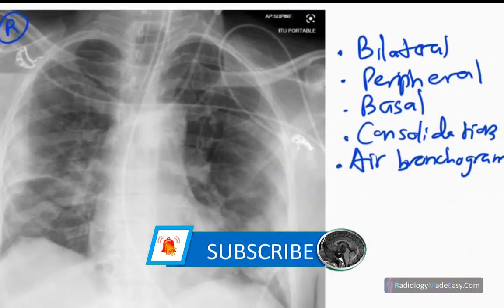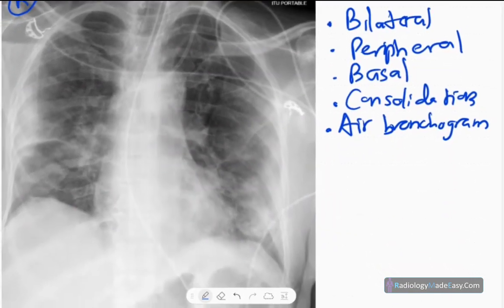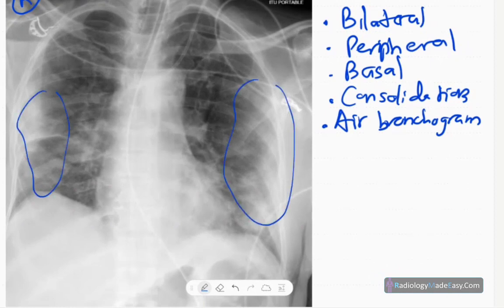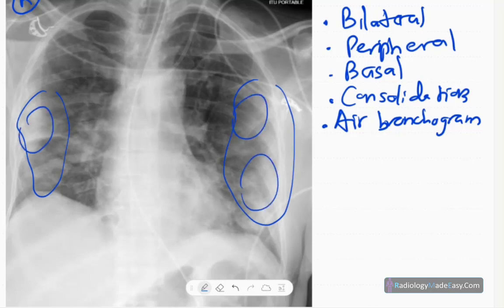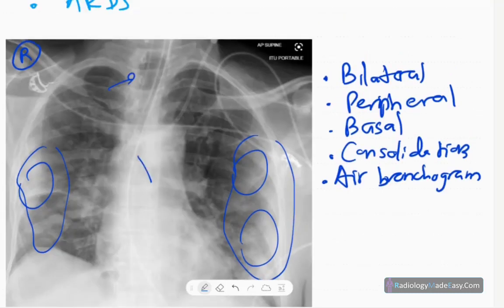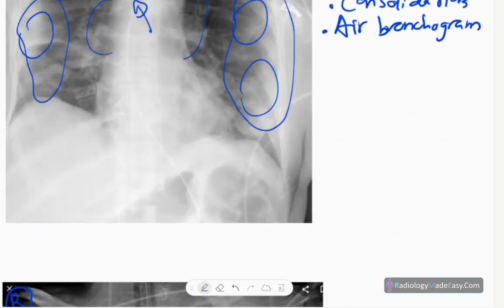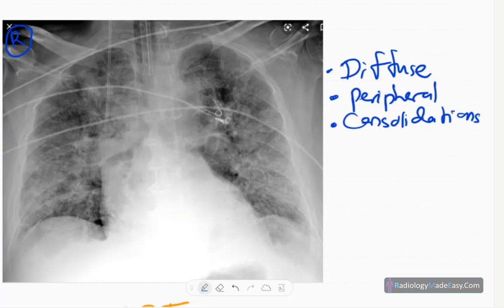As the disease progresses to late stages, you can see bilateral peripheral consolidations with air bronchogram formation. In critically ill patients, an endotracheal tube and NG tubes may be visible along with monitoring leads. There are typically no pleural effusions or pneumothorax in the early-to-mid stages.